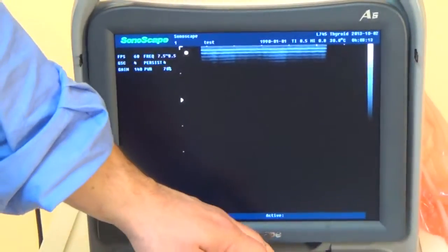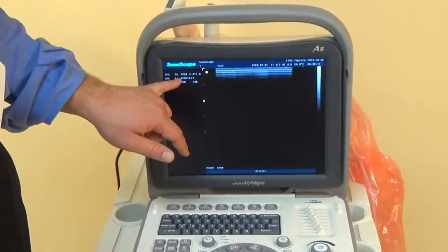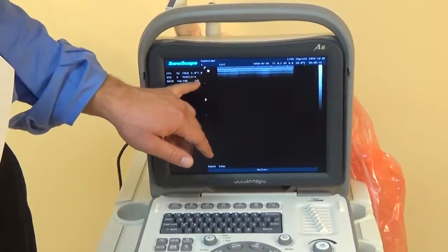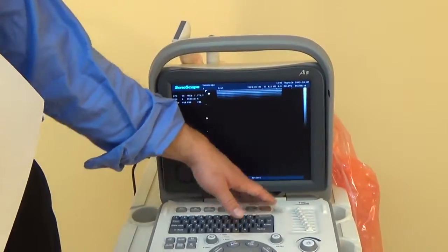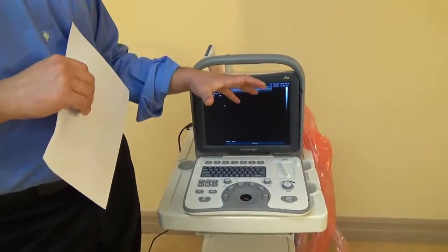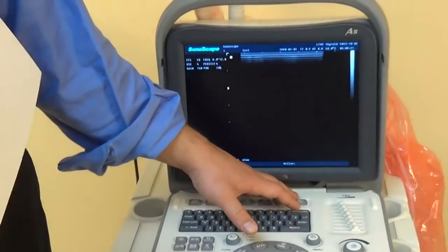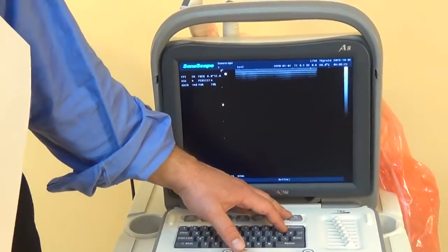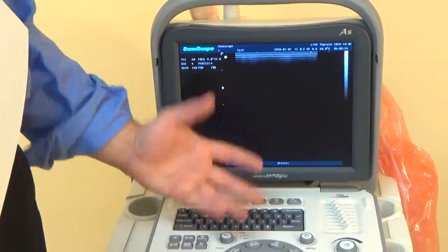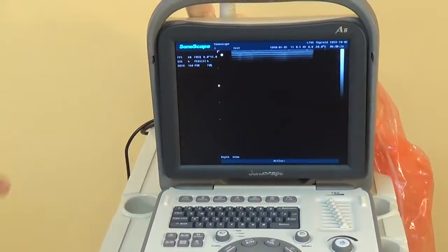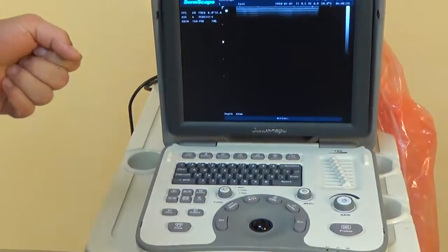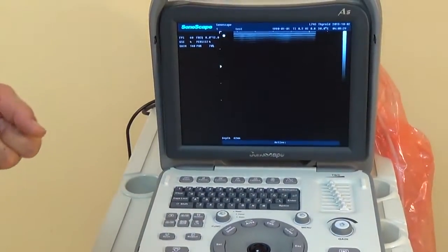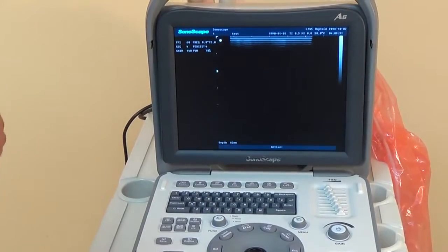And then finally, there's a frequency button. So that changes the number up here. The lower the frequency, the deeper you can penetrate into the tissue, but the less clear the quality and resolution of the image. The higher the frequency, the sharper, the more detailed, but you can't go as deep. So it all depends on what you're looking at specifically for that frequency button.